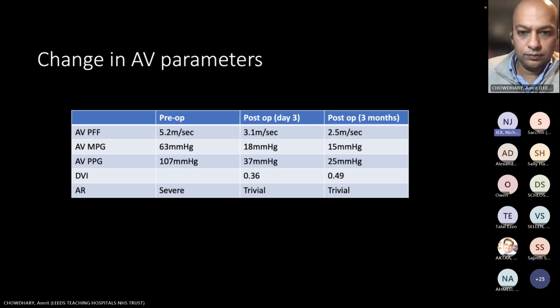We just had a question in the chat about why fluoroscopy was the better option here over a repeat TOE. Well, I think he had a TOE. We sort of got the diagnosis there, and I suppose sometimes the fluoroscopy is just to complete. Did we really need the fluoroscopy? It was really to absolutely confirm the diagnosis that there's a problem and almost get the surgical attention also. And fluoroscopy is such a nice way of visualizing the mechanical valves. And it's so easily done. You know, it doesn't take long. They go down, and it really takes a few minutes.